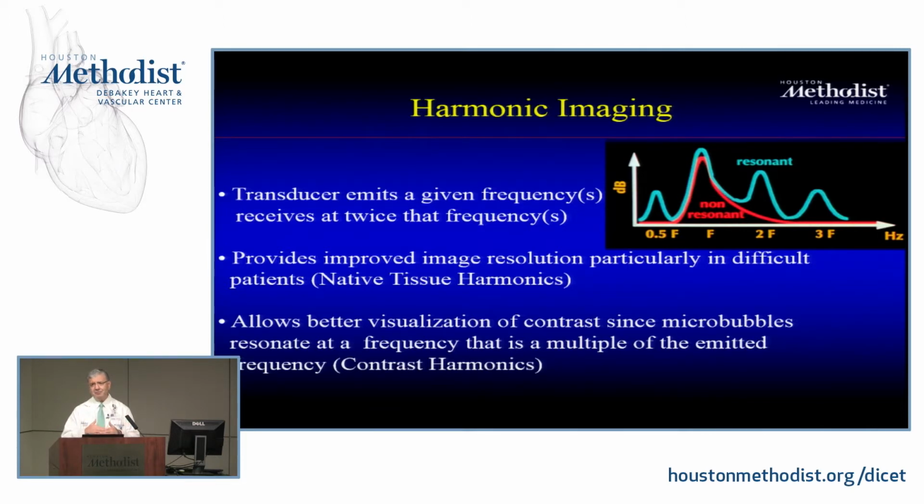It was developed for ultrasound bubbles and then found a nice application in regular day-to-day imaging. And that's the beauty of it. And what is it? Well, we talked about frequency. My fundamental frequency is the main frequency that I'm sending out of the transducer. Let's say that my fundamental frequency is F.